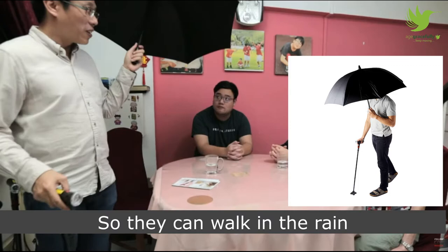It's designed for two persons, so the caregiver or their helper can help them to carry the umbrella, and they can rely on the walking stick itself.